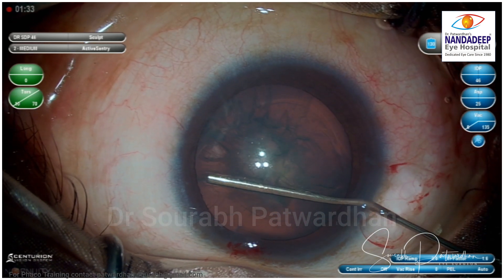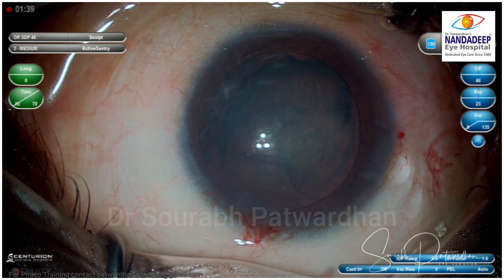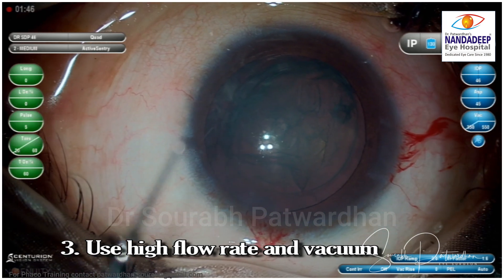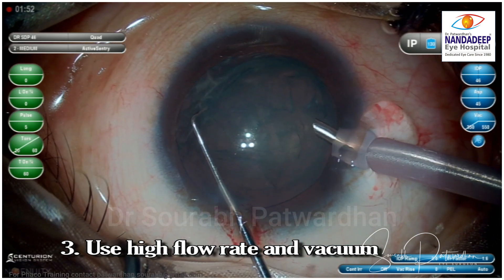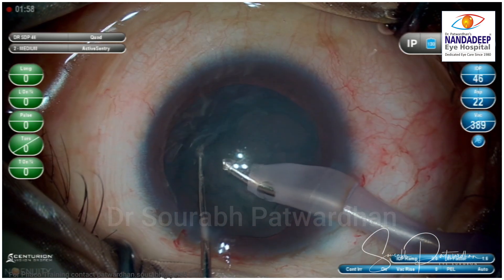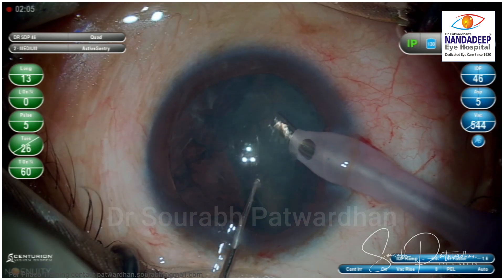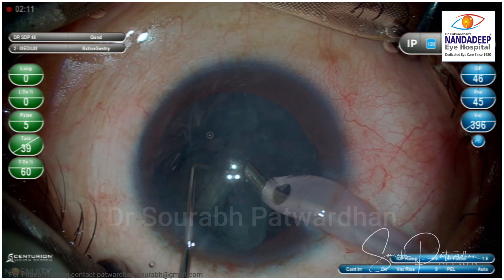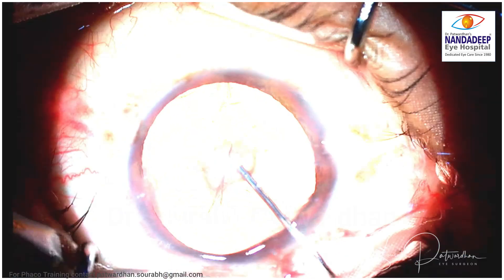This also makes it safer and helps you avoid punching holes in the periphery. This is the right place where I do the last part of hydrodissection. Once the nucleus pole is out, I use the second instrument behind the prolapsed pole. Always use high flow rate and high vacuum, because good followability is important throughout. Once you trim out the peripheral nucleus you can see the nucleus size has shrunk, and with good flow rate and high vacuum — permissible by your machine — set the highest flow rate and vacuum that allows a stable chamber.